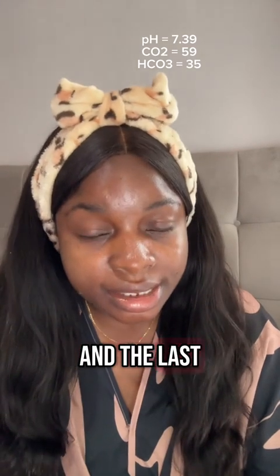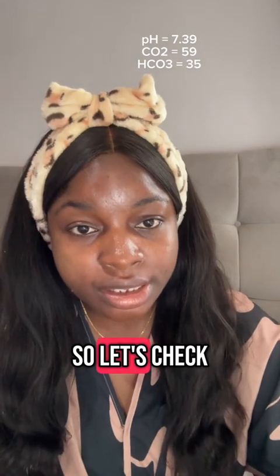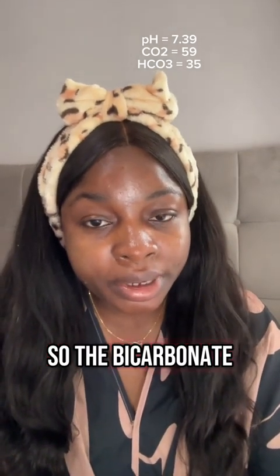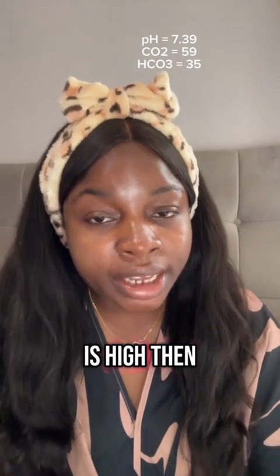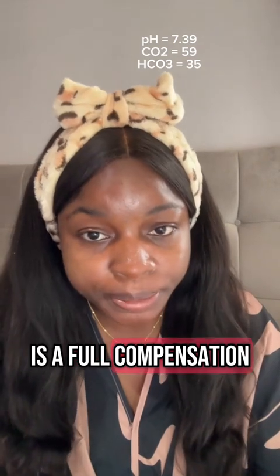The last step is, is there any other organ trying to compensate? Let's check the bicarbonate, which is 35. It's high. So the bicarbonate is high, the CO2 is high, and the pH is normal. That is a full compensation.